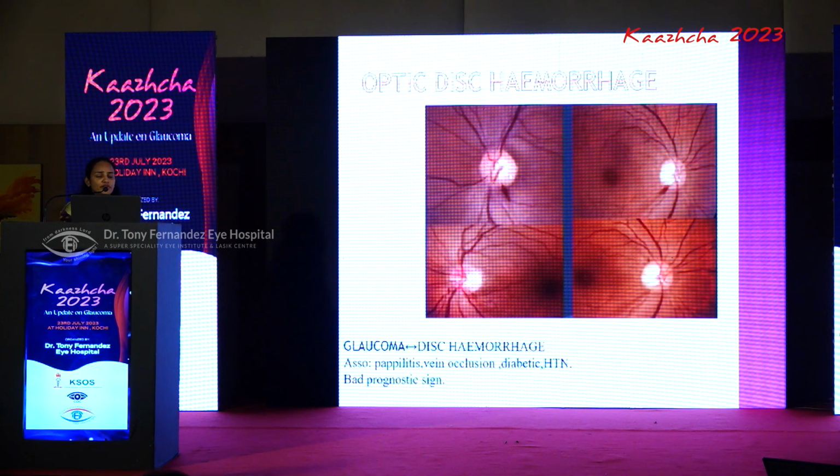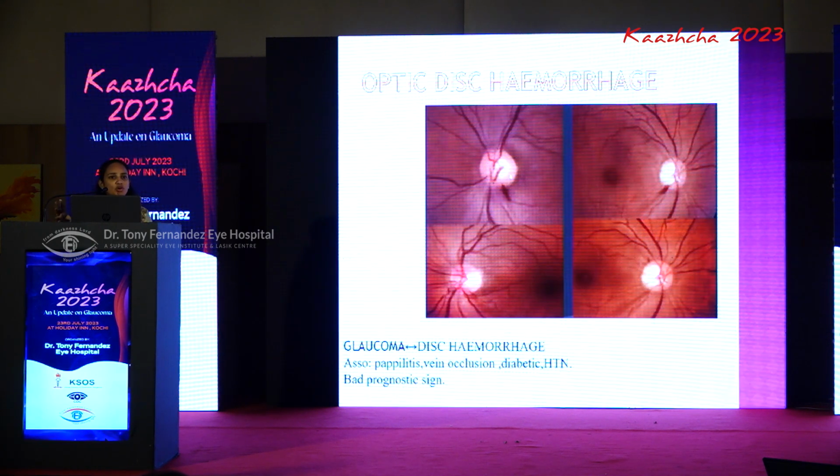Now, optic disc hemorrhage, it is one of the most commonly missed findings in clinical evaluation. Studies have proven that optic disc photography is more effective in picking up optic disc hemorrhages.